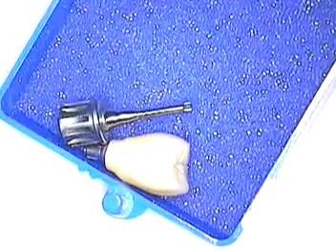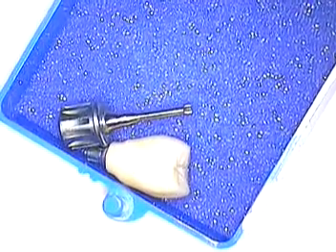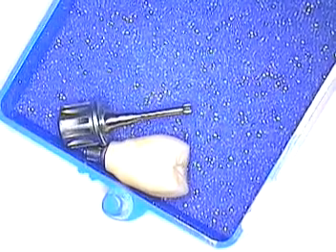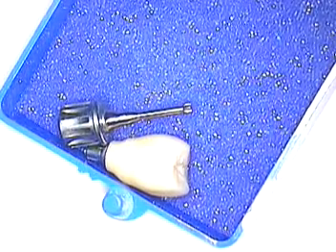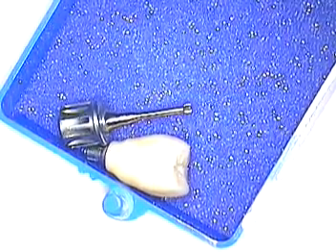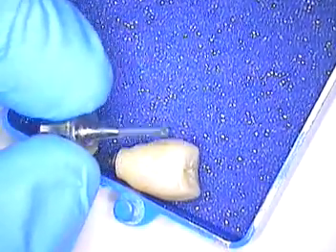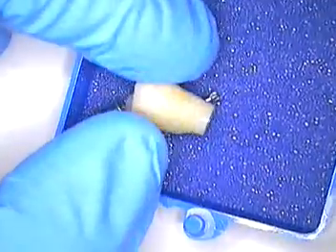This is a screw-retained case. The patient's name is Mark, and we are going to do a screw-retained case. I'm working with a lab that is very good at scanning and design, and we're working with some new components for a fully contoured zirconia crown. Right here you can see the driver for the Straumann kit, as well as the crown that was returned to me from my lab.